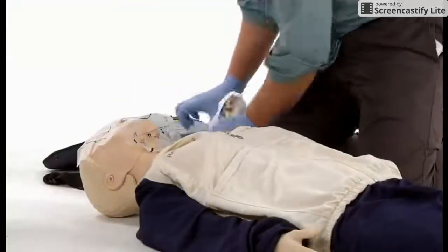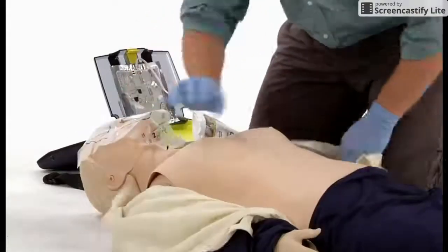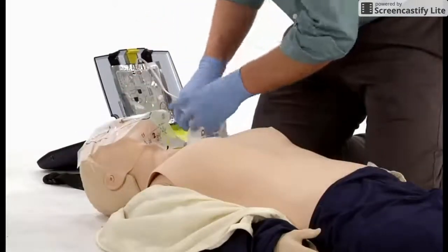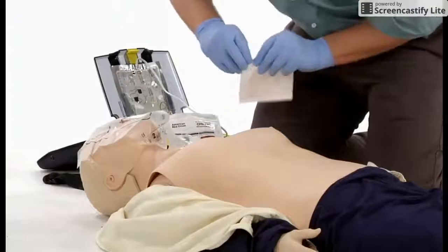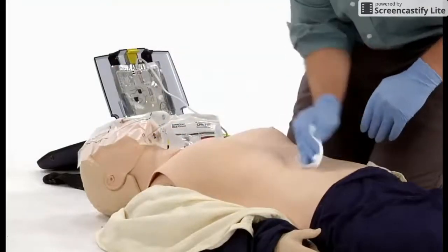Turn on the AED. The AED will tell you what to do next. Press pads firmly to patient's bare skin. Make sure the person's chest is bare and dry. Use a cloth or gauze pad to dry the person's bare skin where the pads will be placed.